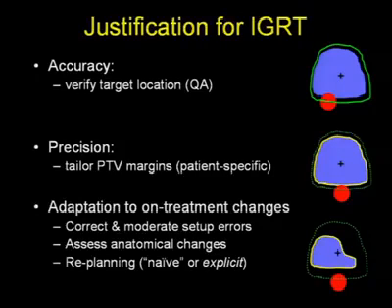And finally, users are also interested in using these images to adapt radiation therapy according to the changes that they see on treatment, so that they can correct and moderate setup errors, and they can assess anatomical changes and address them through a more formal replanning process.